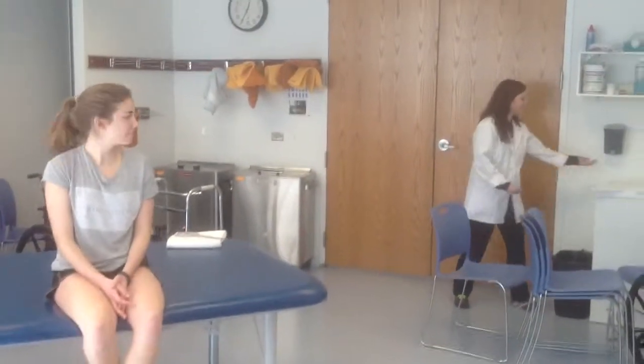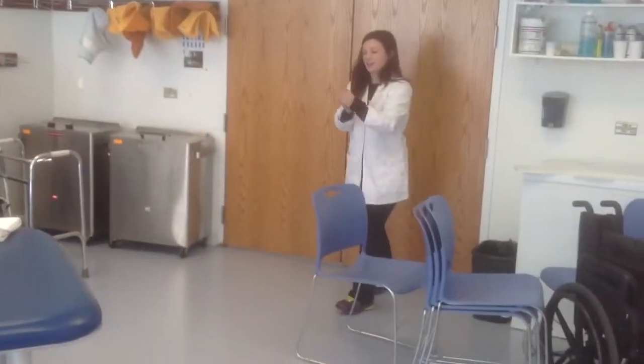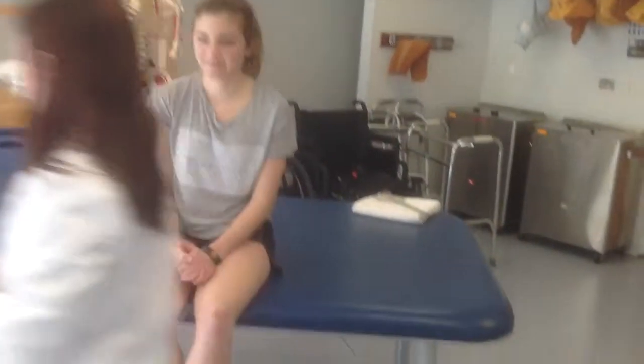Hip Extension Goniometry. Hello, Ms. Corbin. How are you doing today? I'm good, thanks. Good. My name is Megan McFerney. I'm going to be your physical therapist. Today I'll be testing your hip extension. Can I have you lie on your stomach, please?